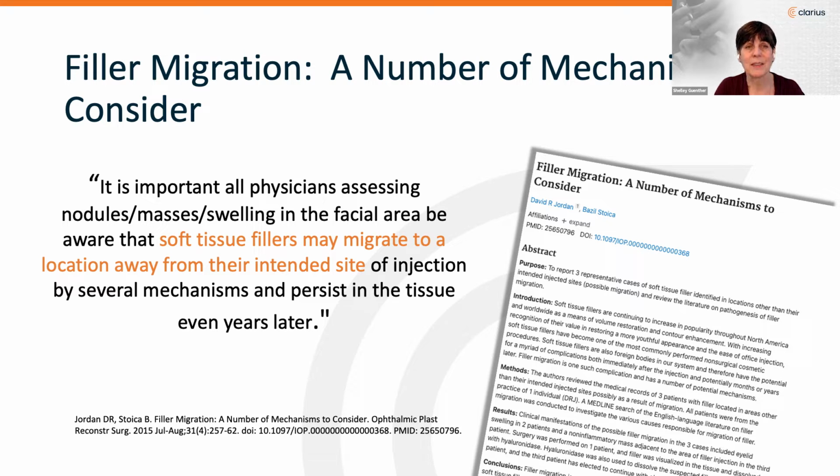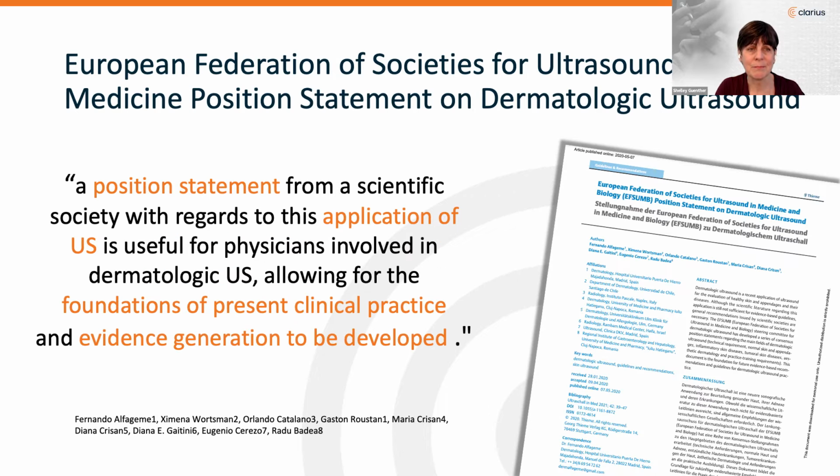And finally, this in-depth consensus from the EFSUMB steering committee for the dermatologic use of ultrasound has developed a series of statements regarding ultrasound of the skin, which includes recommendations for technical requirements of ultrasound equipment used for aesthetic procedures.